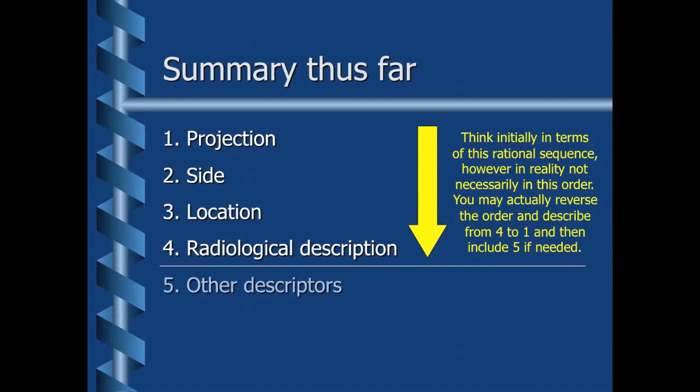However, in reality, it's not necessarily in this order. You may actually reverse the order and describe from point 4 to point 1, and then include 5 if needed.